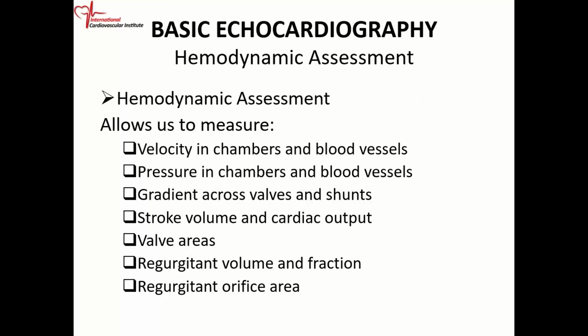So when we talk about hemodynamics, it's basically looking at fluids and fluid behavior. And we can characterize fluid behavior in terms of the rate of the flow. We can talk about the velocity. There's a lot of things we can use to characterize fluids. In this case, though, we're looking at blood, the movement of blood. We're looking at the velocity of the blood in the different chambers and blood vessels.